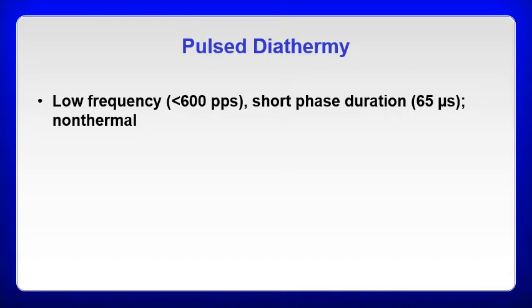So you essentially have those 3 different levels, or 4 different levels if you're counting the non-thermal. You have those same levels with pulse diathermy as you would with ultrasound. So the 1 degree increase for the subacute inflammation, the 2 to 3 degrees for the chronic inflammation, muscle spasm, and pain reduction, and then the 4 degree increase for the stretching.